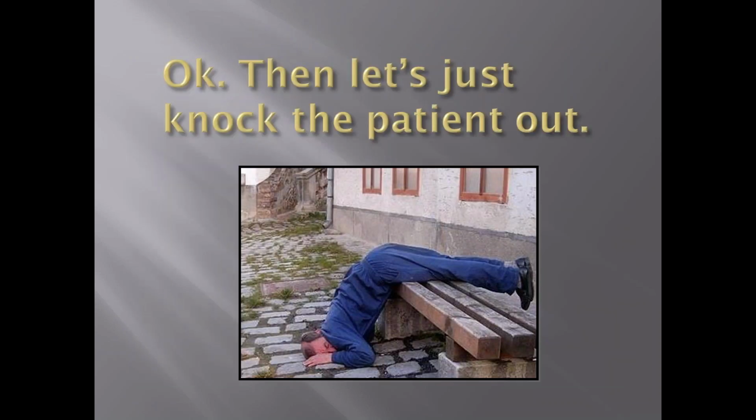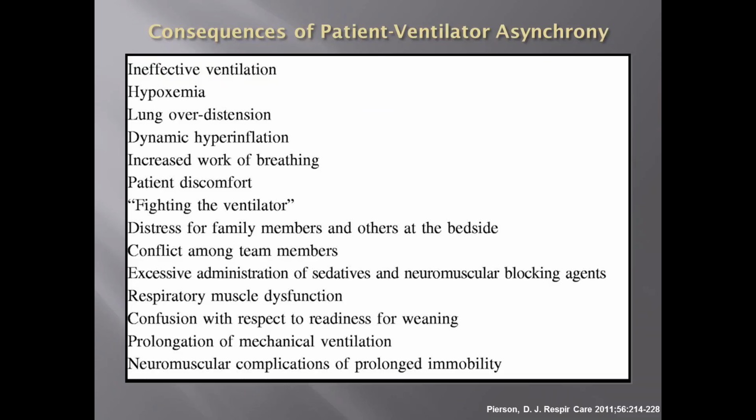Okay, so I just told you that asynchrony is probably bad. So what if we just knock the patient completely out, right? Is this going to be good for the patient? What happens when we use heavy sedation for our patients?